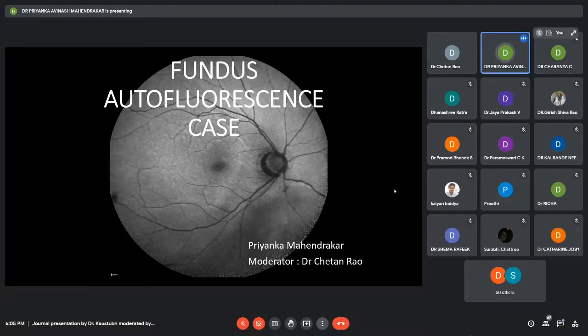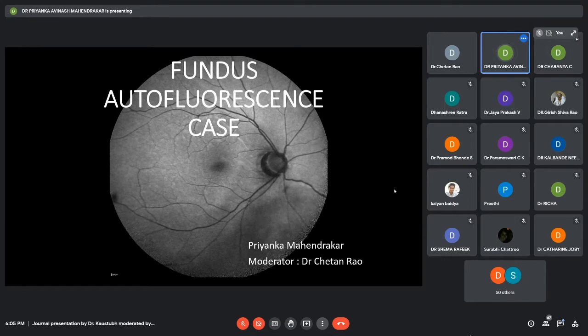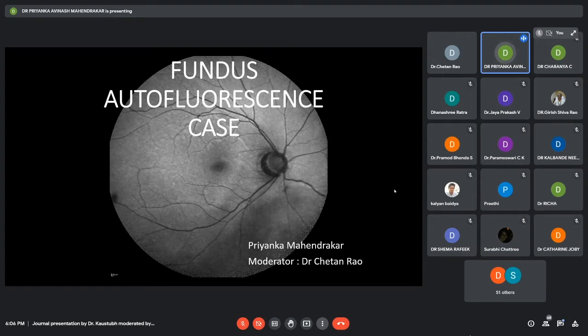So today's case presentation is on fundus autofluorescence cases. I will be talking about fundus autofluorescence in retinal detachment cases today.